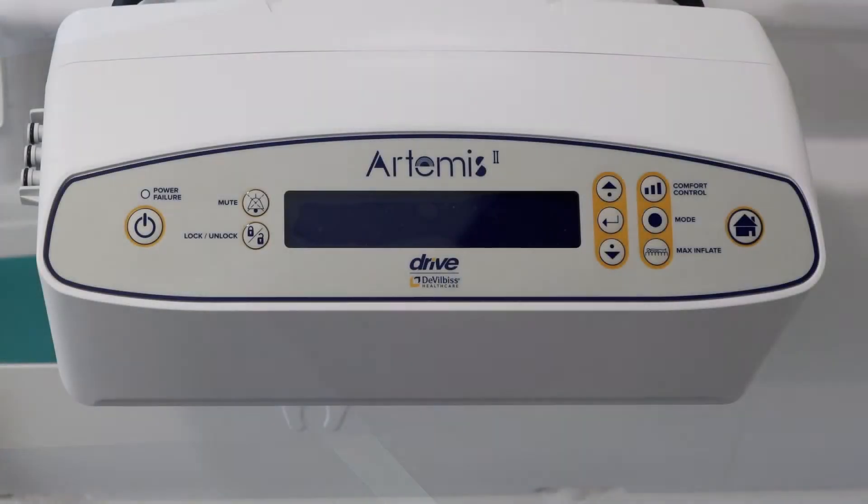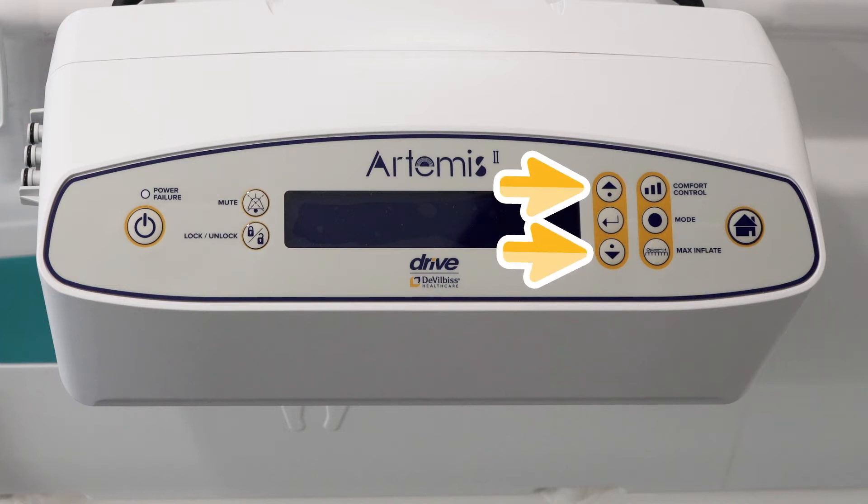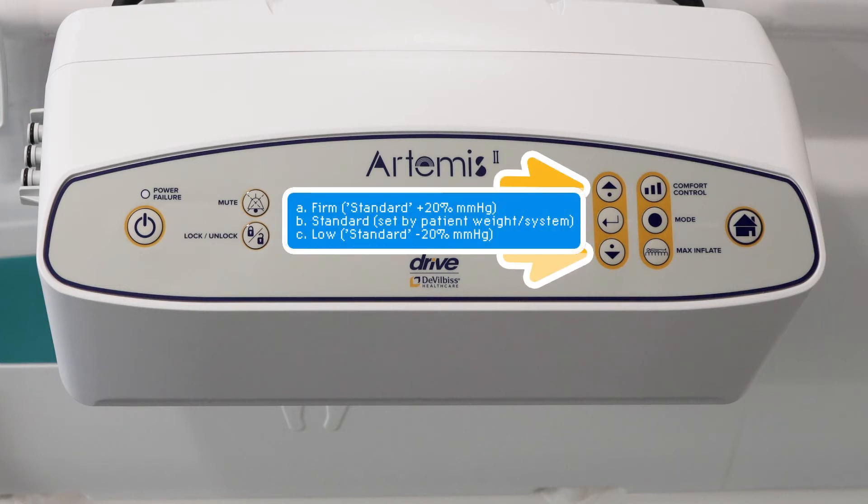The digital control panel on the pump has a power button, a mode button which includes alternating, constant low pressure and pulsation, and a maximum inflation button which lasts for 20 minutes. The comfort control button includes firm, standard and low settings. The changes up or down are low to firm, which increases the pressures by 20% or decreases the pressures by 20%.